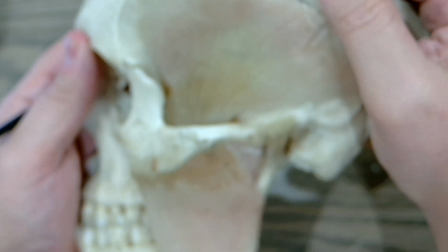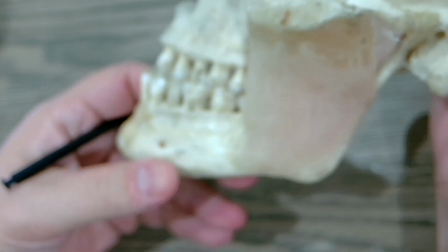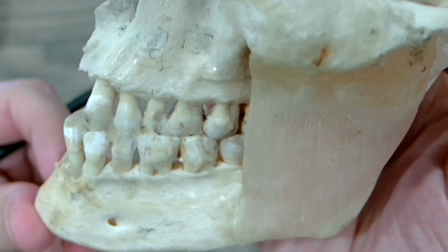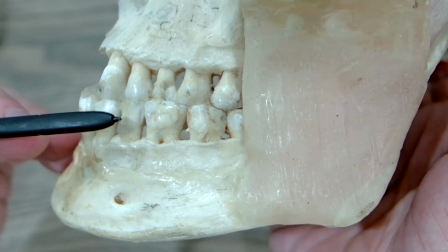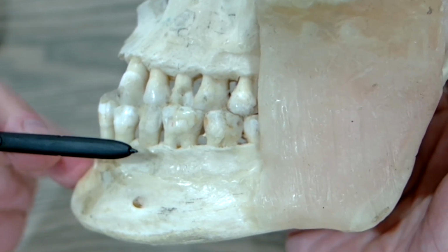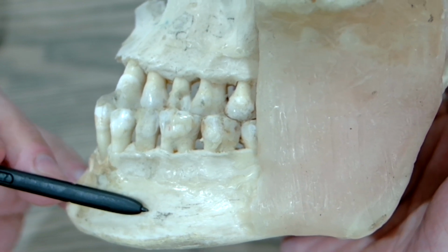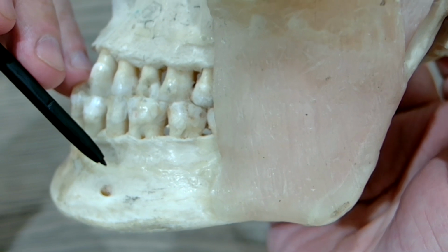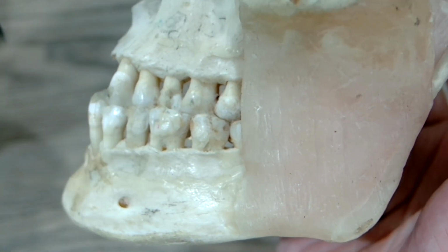By covering some anatomical considerations for implant placement when it comes to the mandible. A couple of things to keep in mind here with the mandible when you're placing in the first or second molar regions. The superior border of the inferior alveolar canal is typically 3.5 to 5.5 millimeters below the apex of the first molar.